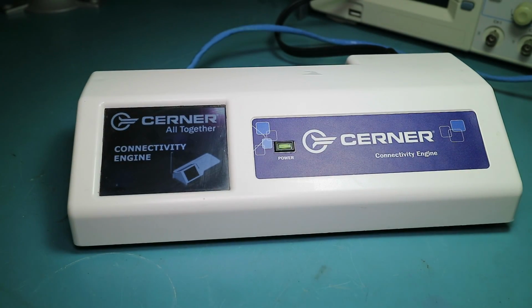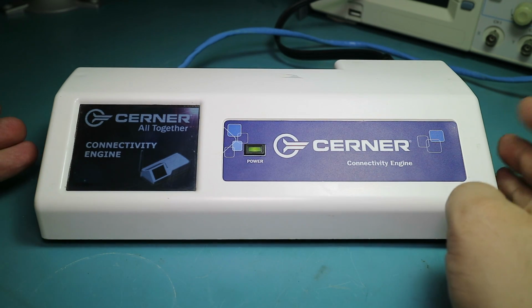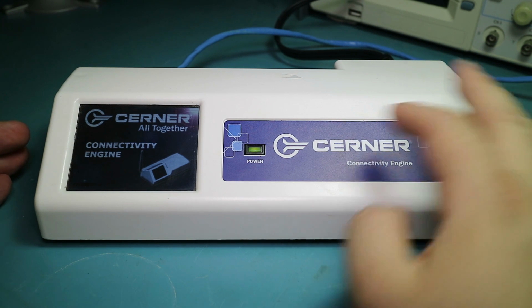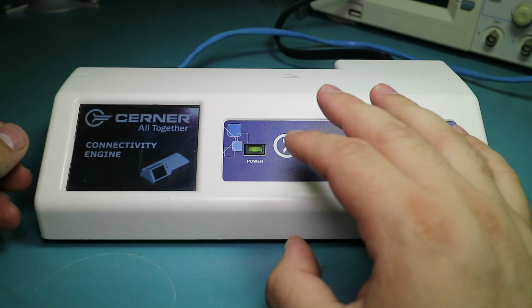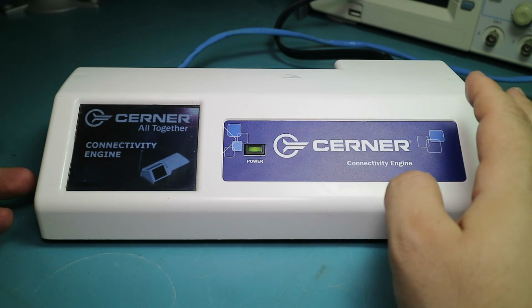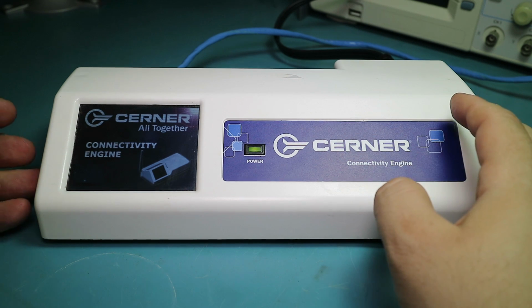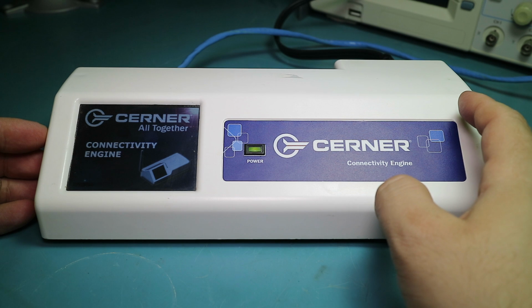Anyway, the FTP server basically is just a file directory listing, and I was able to copy most of the files off it. It has a bit of flash memory, which we'll get into, but the telnet server does the exact same thing. You log in and it's just a directory listing, and you can just basically use DOS commands. So there's really not much to it.